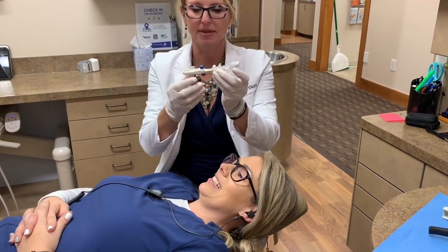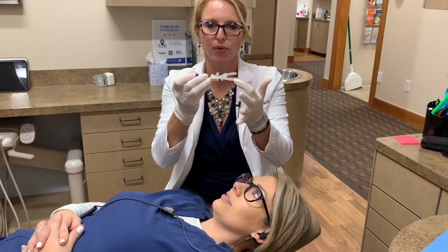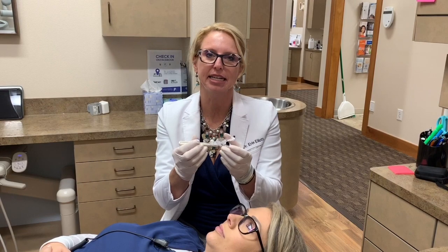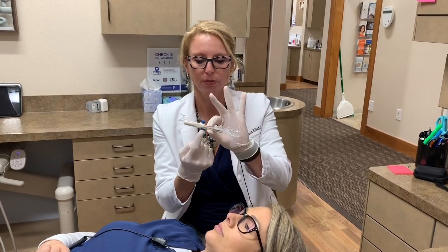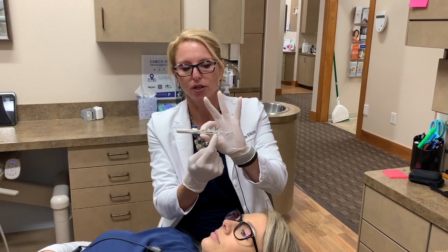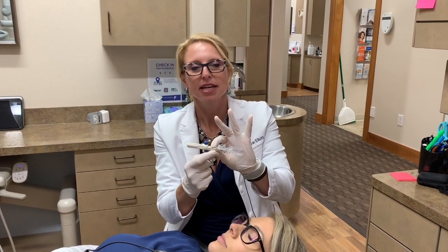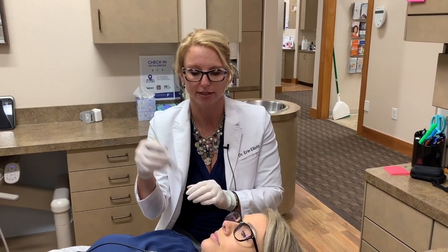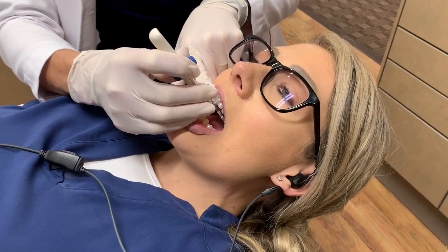With the SOMGAGE, we make sure it's set up correctly and inserted into the gauge itself. The bite fork is a uniform 3mm so we get the proper amount of separation and avoid calls from the lab saying there's not enough vertical. We want it to flow and slide easily, so we keep this screw loose so it slides. The lower screw we keep tight because it's more universal — the lower anteriors fit right into this section. I use my middle finger to stabilize the fork so it doesn't go flying off.